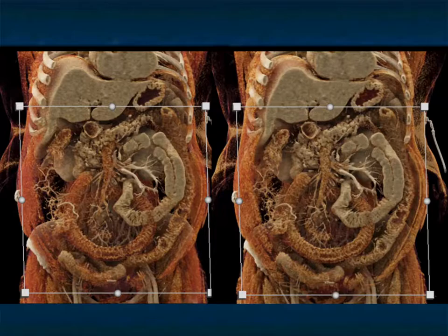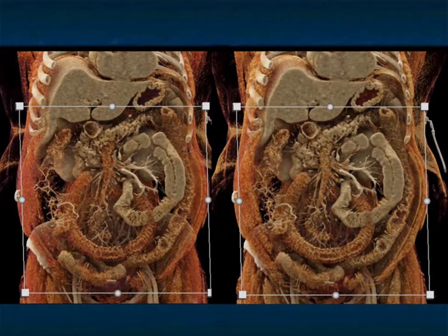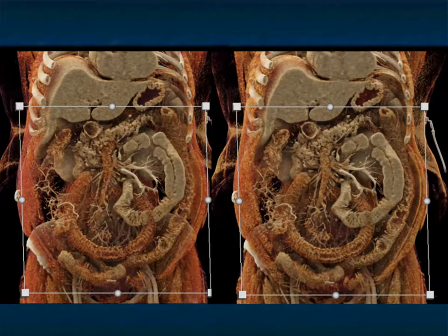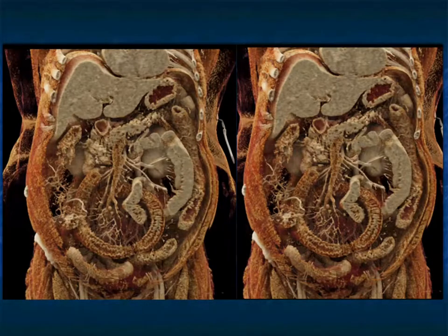You can see the small bowel more distally is red — remember, red means water, it means edematous, enhancing edematous, prominent fold pattern, prominent haustral folds — all of the things you think about with inflammatory bowel disease.